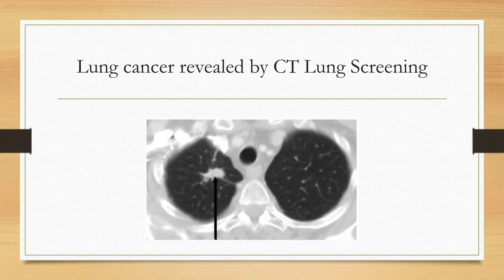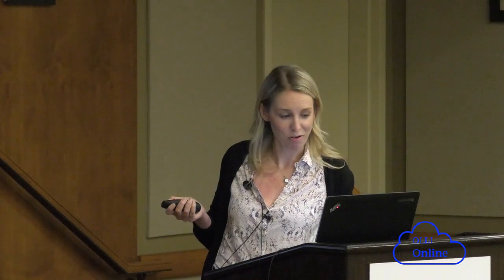This is just an example of what a lung cancer screening looks like with a mass. So this is the CT we looked at earlier. You remember we could see the bones really well. This is windowed, so we just see the lungs. So this is lung here, this is lung here. And these little dots are the little vessels supplying the lungs. And here's this mass. It's in the right lung. It's spiculated, irregular. So that's concerning for a lung cancer. So this is one that was recommended probably for Dr. O consultation for removal.